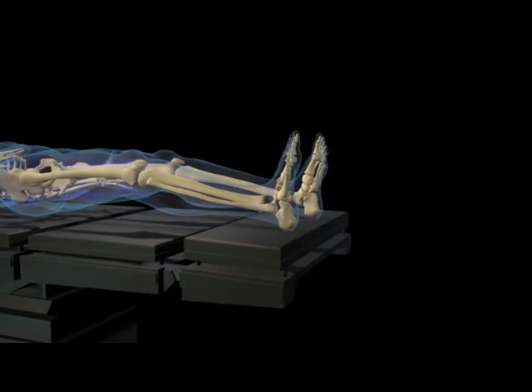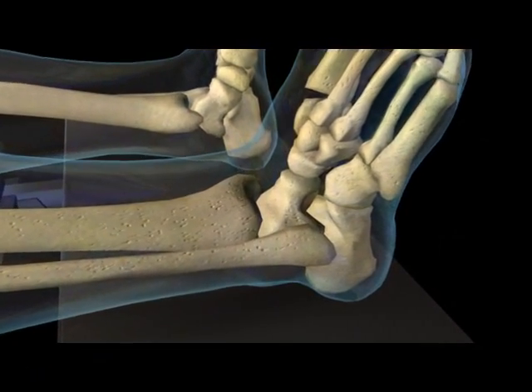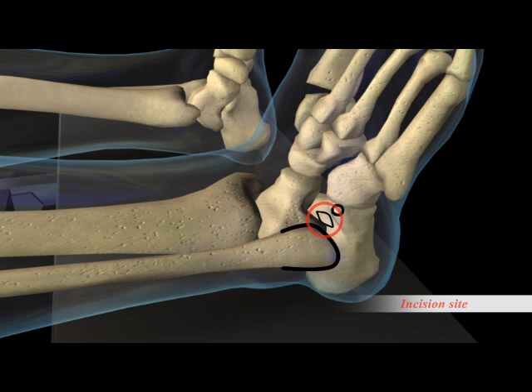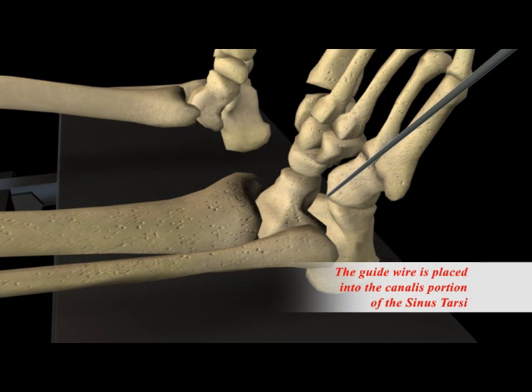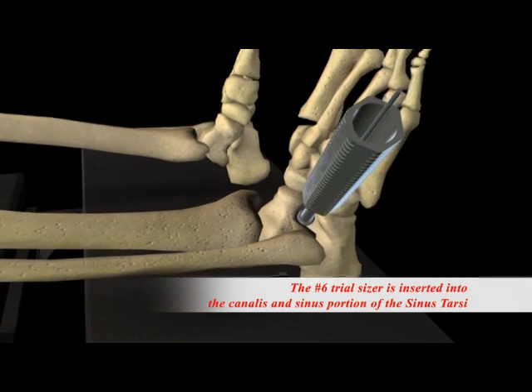These are the trial sizers and driver needed for the procedure. This is performed through a minimally invasive procedure using either local sedation or even a local anesthetic placed just into the foot. A small incision is made over the sinus tarsi, and at this point superficial and blunt dissection is carried down through the sinus tarsi. A guide wire is placed within the canalis and sinus portions, and then a trial sizer is inserted.